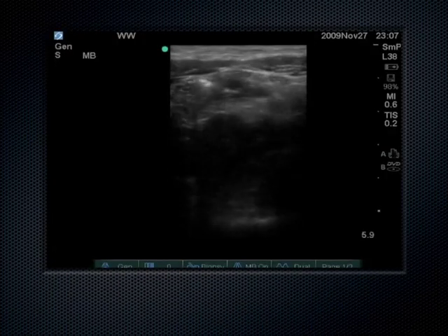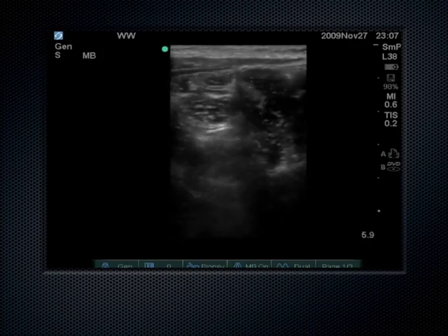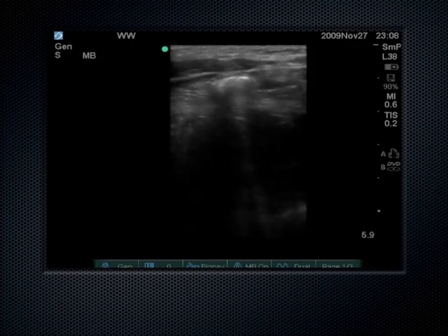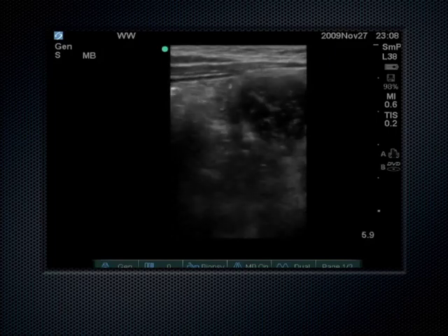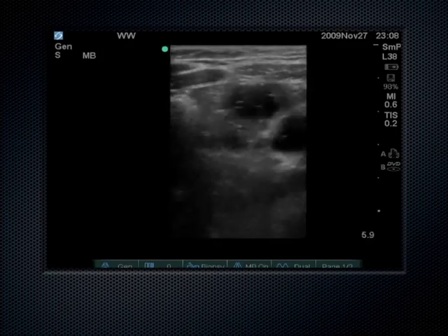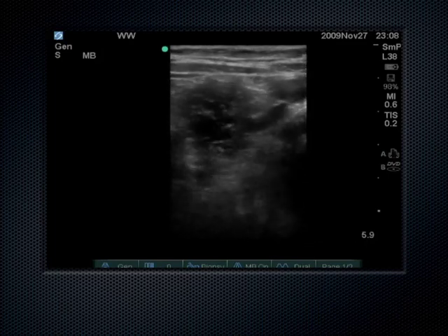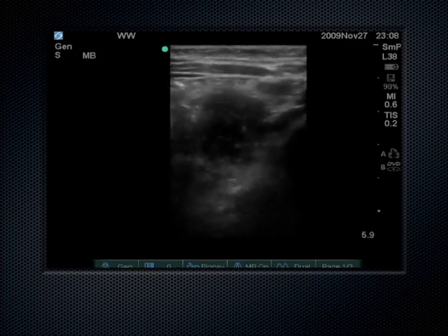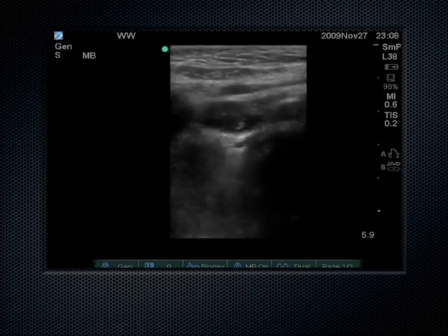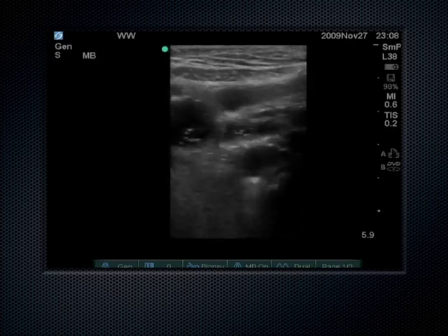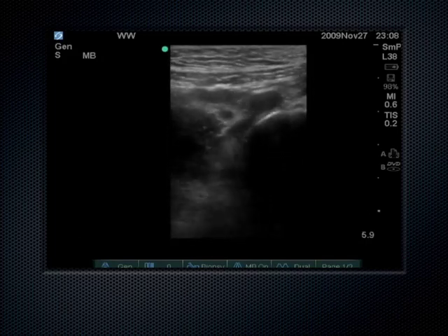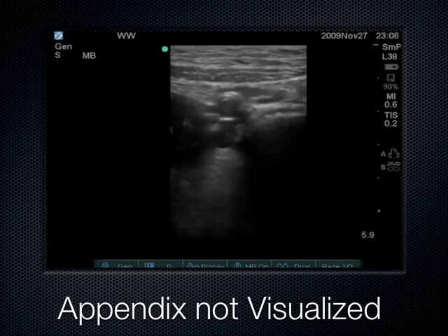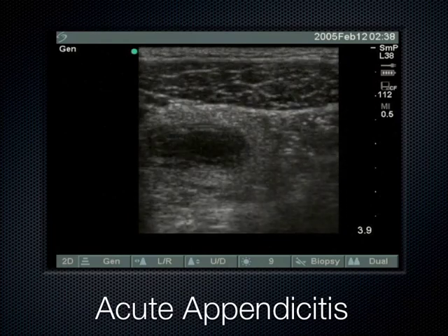Here we're compressing, with the psoas muscle practically coming to the abdominal skin in this very thin patient. When the appendix is visualized, it gets sandwiched between psoas and abdominal wall musculature. When you have appendicitis, all those areas in the peritoneal cavity get inflamed and it's very painful to compress. In this particular case it was normal — no appendix seen — and the subsequent CT scan was also negative for appendicitis.